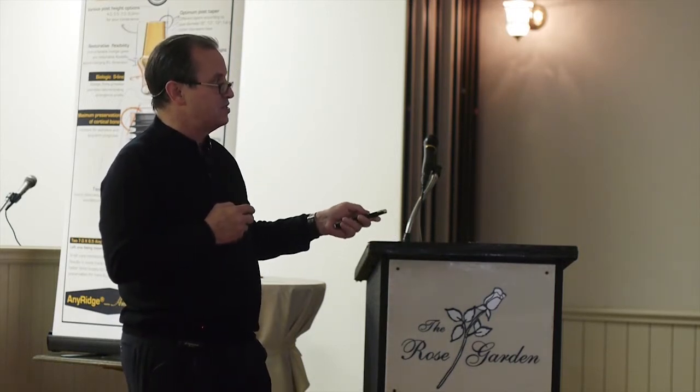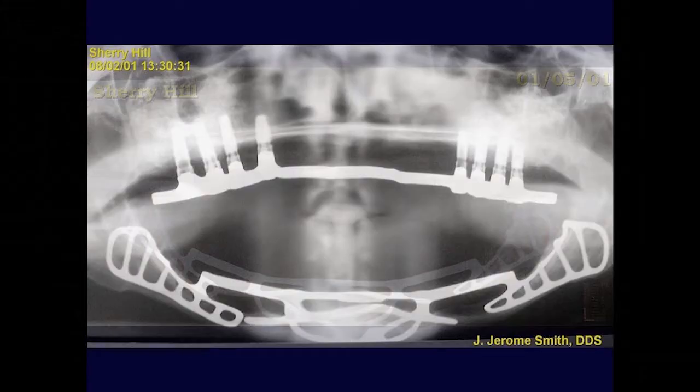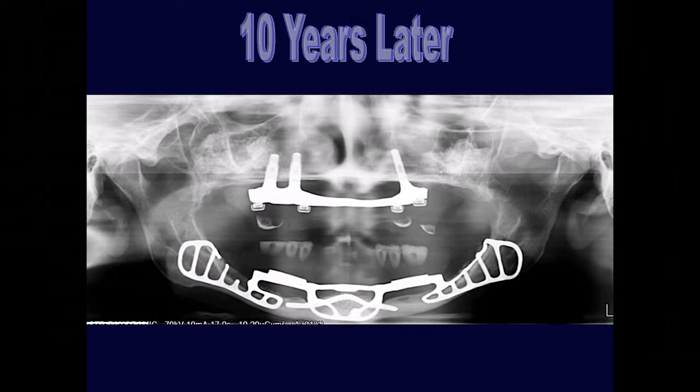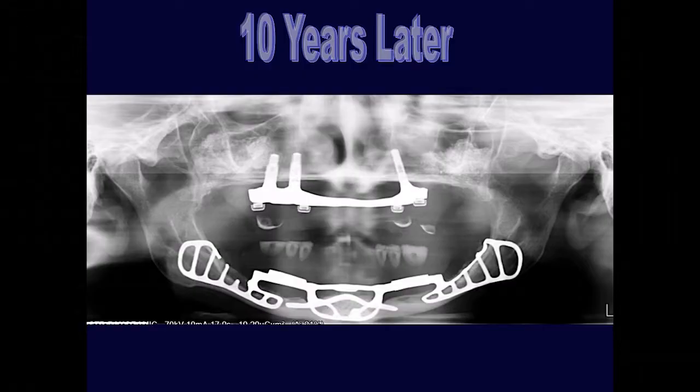Sinus lifts on both sides. These are Stereos Hexlock implants. There's the bar that I just showed a little while ago. 10 years later, take a look at this. Okay, look at these implants. 10 years later, look at what we got left. For some reason with those implants, you just started seeing the tissue and the bone resorb up vertically, and I don't even know why. I don't have a clue. And you see over here, we had some strut exposure, so we had to work with this. But this has held up very well. I mean, she's doing fine with this.